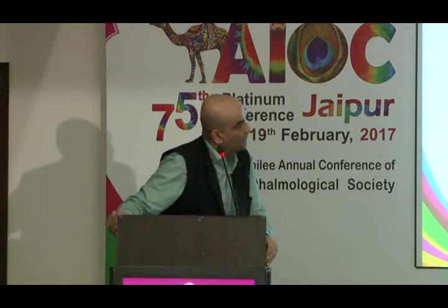My question was, what do you do when it is opened upside down? You take it out. Very good point. If you can catch the hole opening on the right or the left side, whatever lens you're using, till the point it's nearly 60% in the eye, you have enough time to pull it back. Now, in case it has gone in, you need to make your incision 0.3 millimeter larger. Then pull the lens out, reset it, and put it in again.